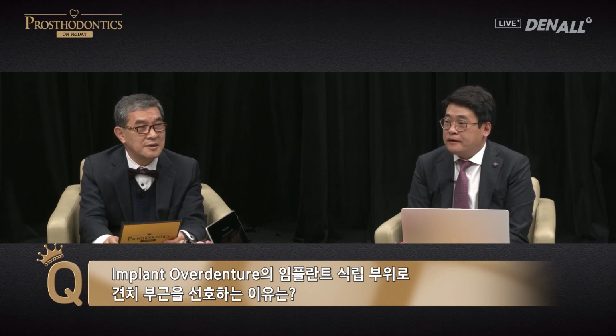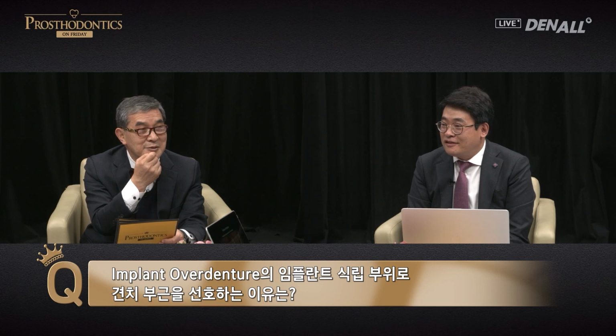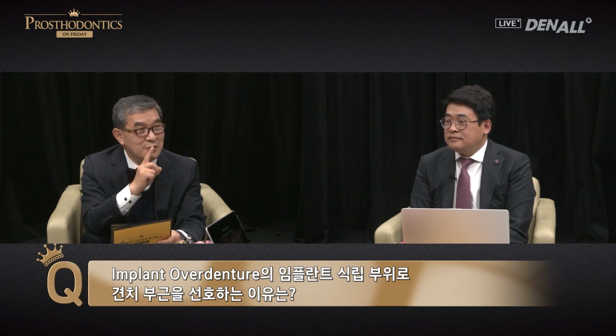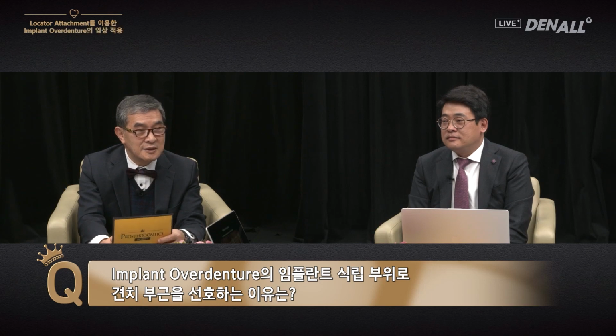When I taught in college, I brought in students in their 3rd year in dental school and did perio tests from tooth number 1 to 7, both in the upper and lower. The result was that the Periotest value was the best in canine. When we just think about it, canine is a single root tooth. On the other hand, number 4 and number 6 have 3 roots. How come canine has better results?